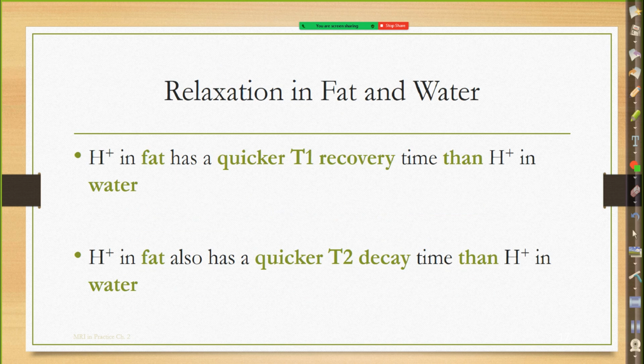So hydrogen in fat has a quicker T1 recovery time than hydrogen in water. We'll figure out what those values are by the end of this unit. But we know it's in milliseconds. And hydrogen in fat will also have a quicker T2 decay time than hydrogen in water.